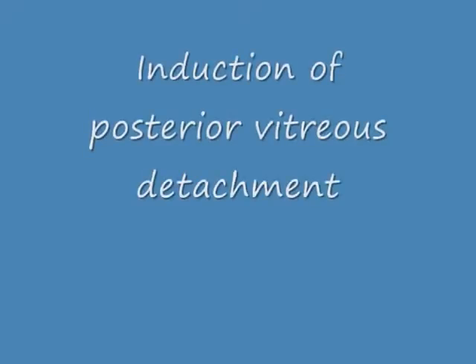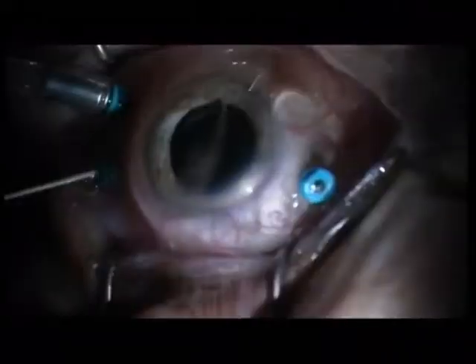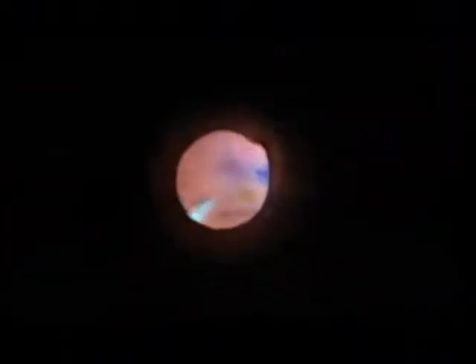This is a nice contact lens from Oculus Germany. The first step is a PVD under contact lens. I want to be careful — I don't want to damage the macula. So this is a careful central PVD. Then I remove the contact lens to extend the PVD to the periphery.